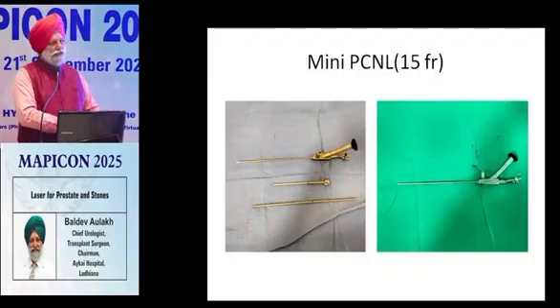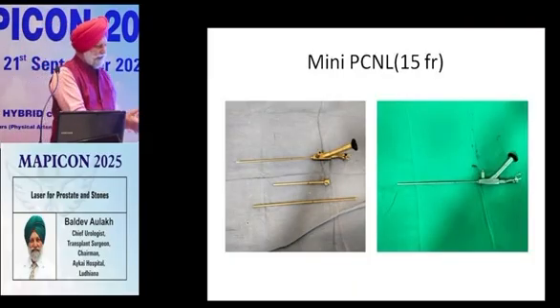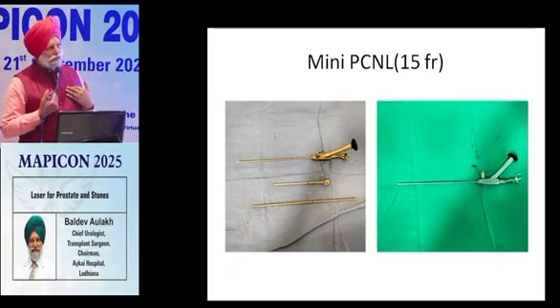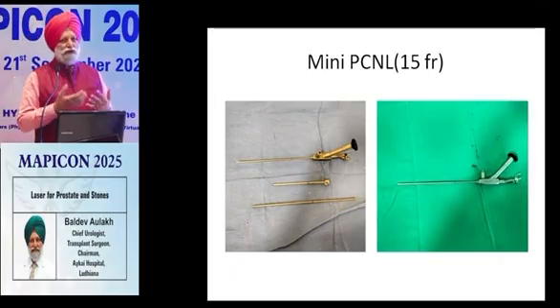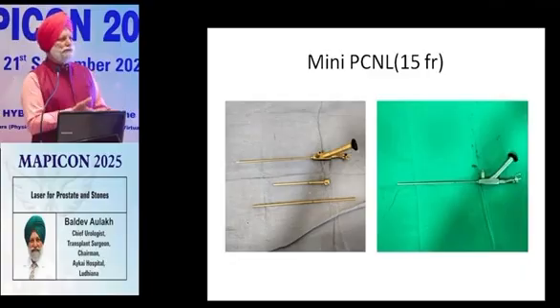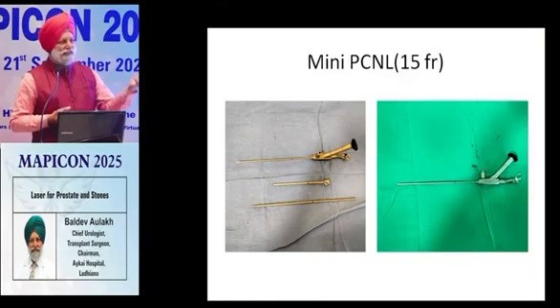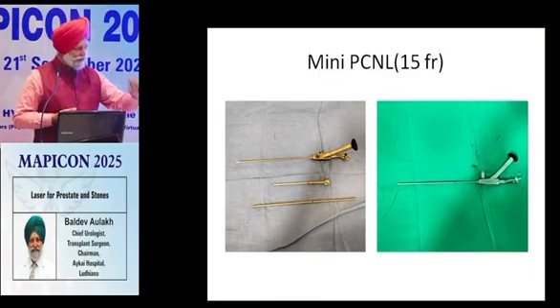But stones cannot come out like that. You have punctured the kidney and you see the stone. You have to use some energy source to break the stone and then remove it. As I told you, for breaking the stone, the laser is the most powerful energy system. It is not that the patient will say, Doctor, laser kar do ji. So you will see where the laser is more beneficial, where it is not, whether it will break the stone or not, and whether it will even reach it or not.